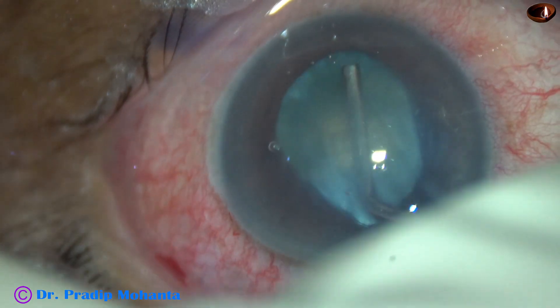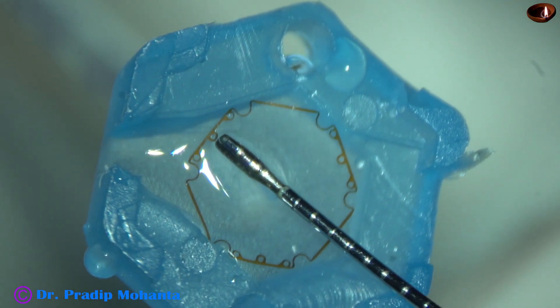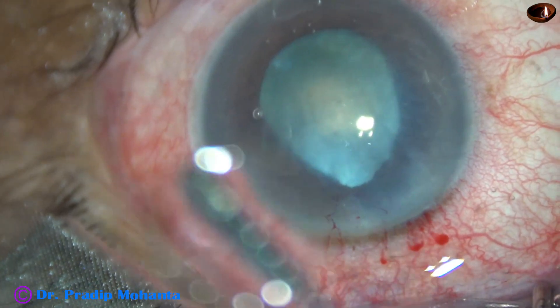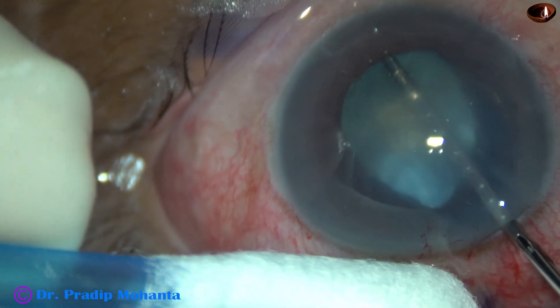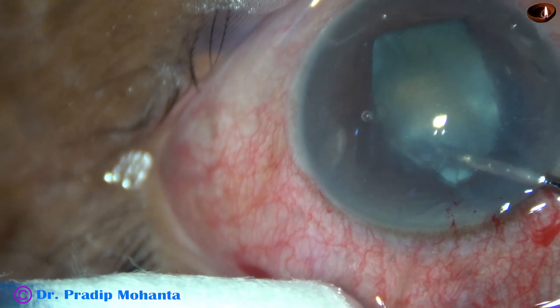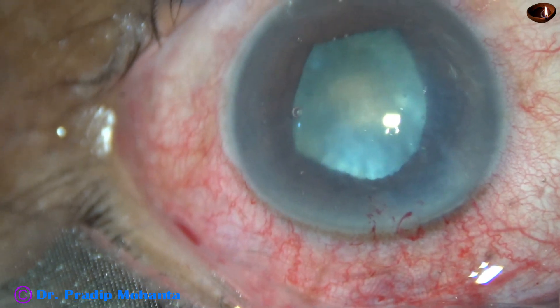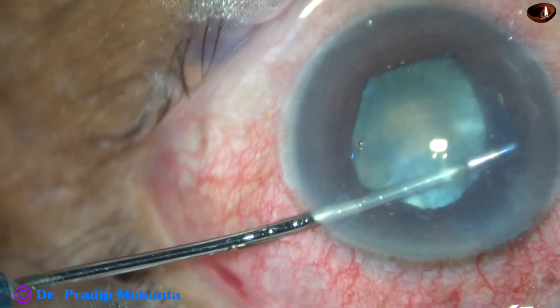So I inject Visco. My plan is to apply a B-hex pupil expander. My assistant gave me fixation forceps, but you can see the blood vessels are already congested. If I use any forceps, there will be subconjunctival hemorrhage. Instead, I used a Jansen retractor. The leading flange as well as the flange at around 1:30 o'clock has been tucked. Now I go through the side port and tuck the flange which is at around 10 o'clock.